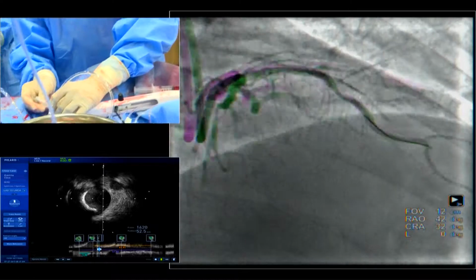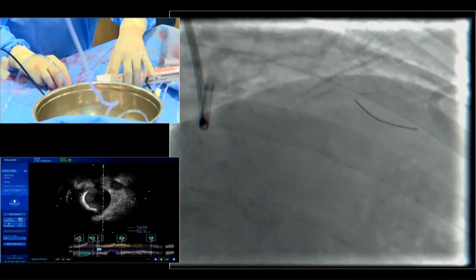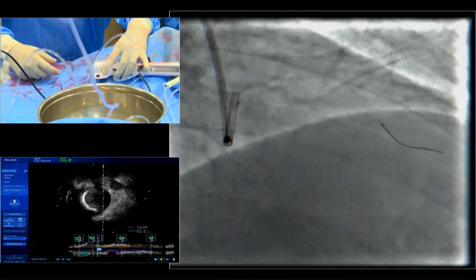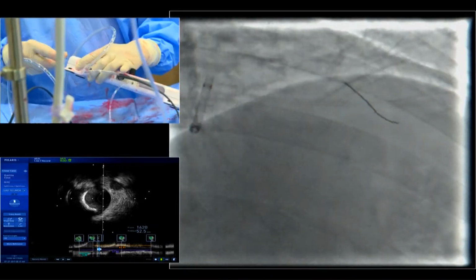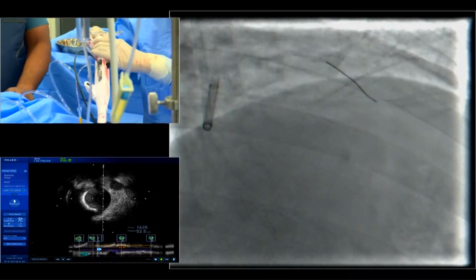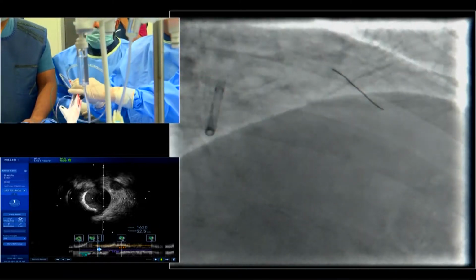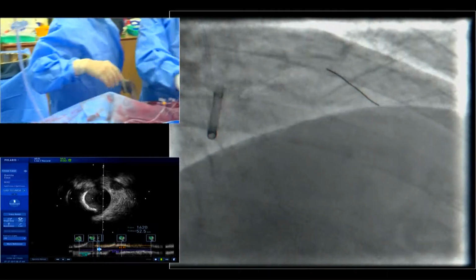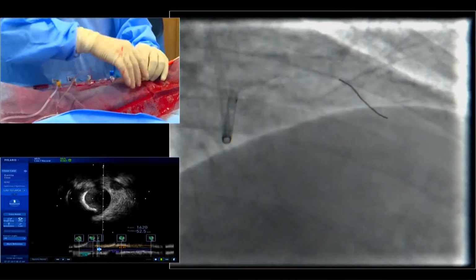Now we will come out with the rota. The mid part of the LAD is actually not a calcified lesion because it is severely fibrotic. You just avoided it. Okay, so I will not go there. There's no point going there with a larger bar. There may be dissection and also your wire is coming out. I don't require the wire anymore because I'll just put a BMW there.